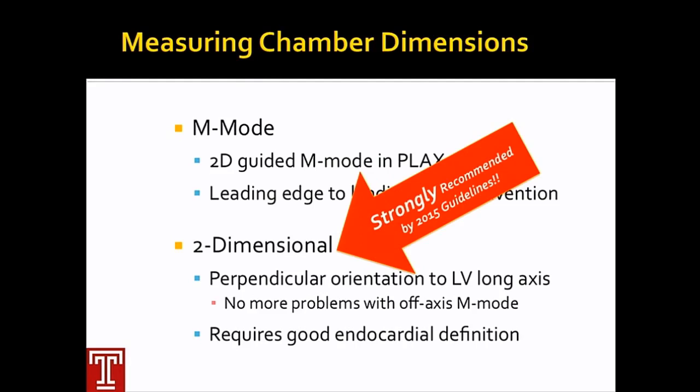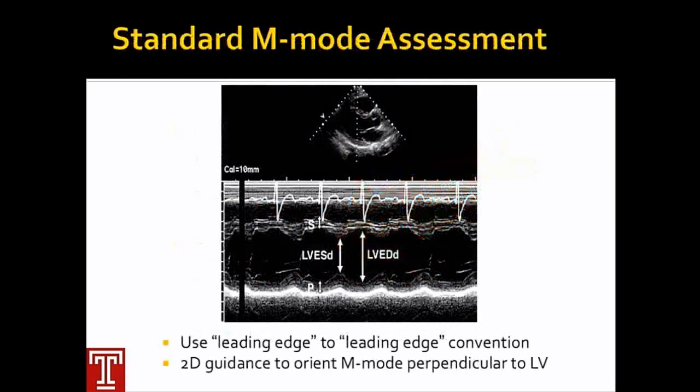So most of the measurements that you'll be seeing on the exam will be given to you. I have not come across any instances where you actually are taking out calipers or trying to measure it yourself. They are usually given to you, but you may need to be aware of whether or not they're on axis or are being done appropriately.